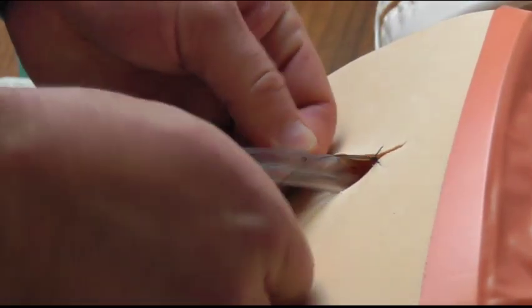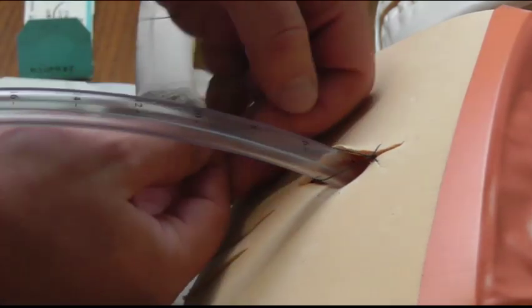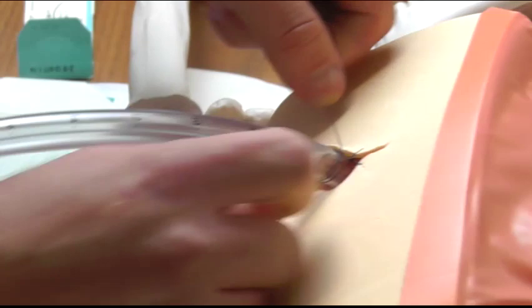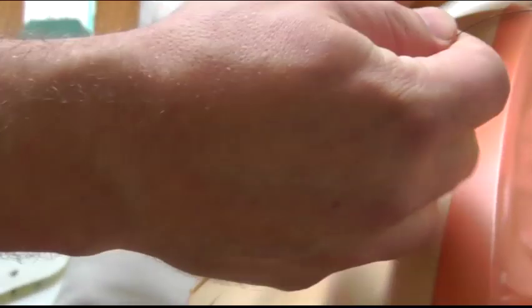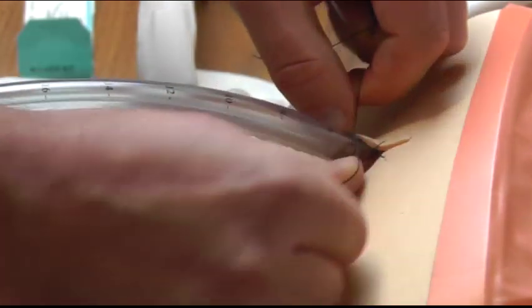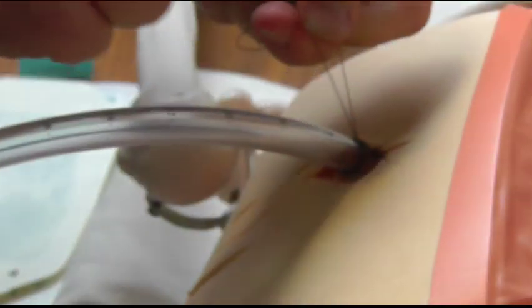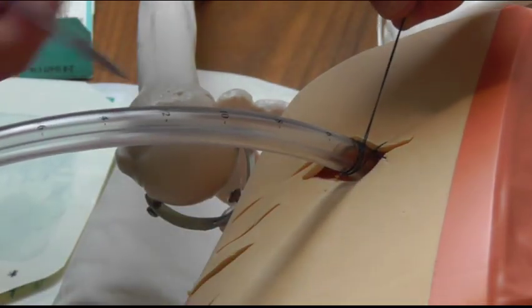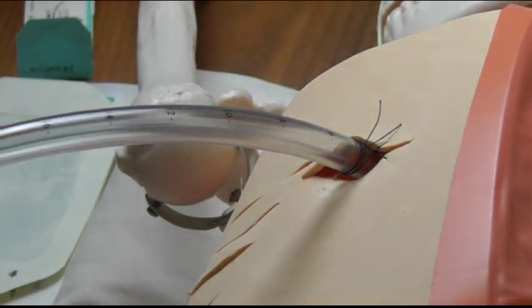So what we're trying to get people to do nowadays is actually just go round and round the tube close to the skin. It doesn't have to be super tight, but relatively tight, relatively close to the skin. Leave yourself some room to tie some knots, and try and slide it right down so you're relatively close to the skin. So there you go. You can see you've got one tie very close to the skin, and your skin's nice and tight around it.